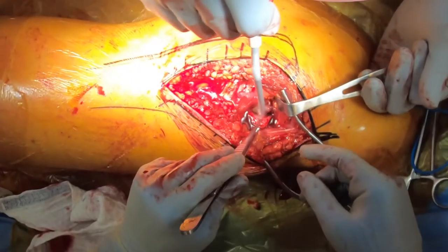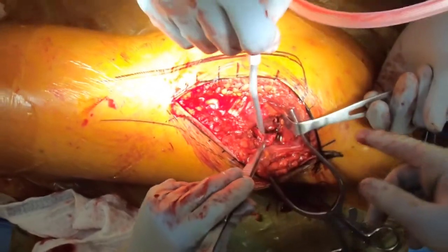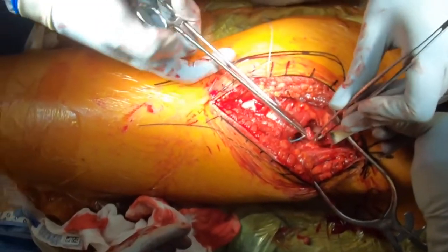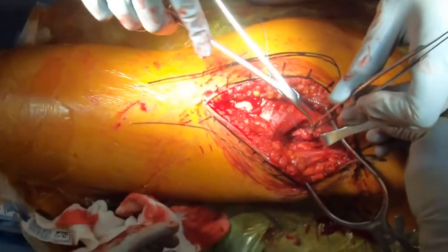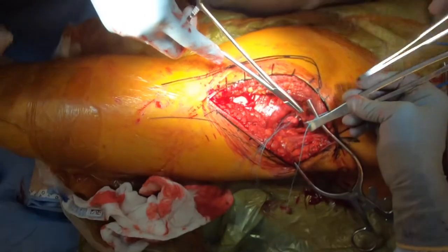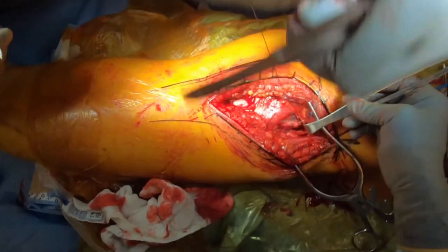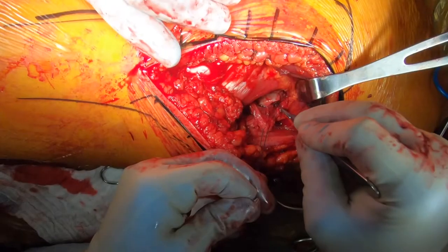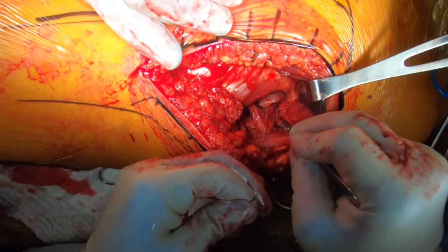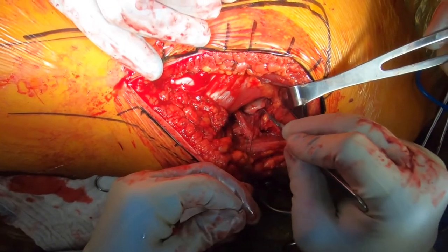The corner of the capsule is then tagged with number two Ethibond. The extent of the capsulotomy is brought towards the labrum but not through the labrum.